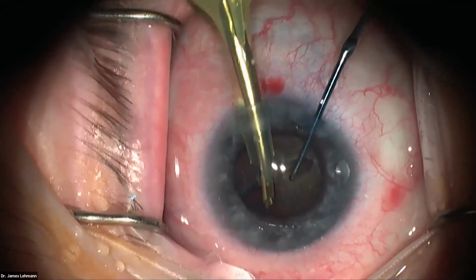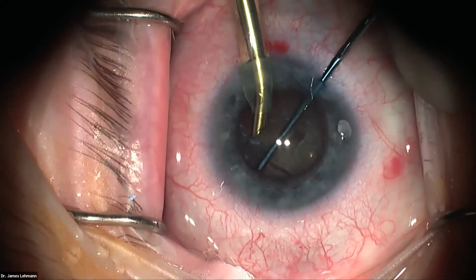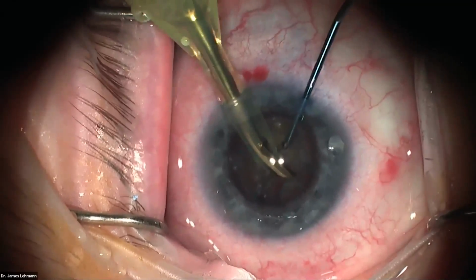Okay, so instead of going and reaching it here, I'm going to go ahead and rotate that and try another piece, since that little shelf on the anterior part is gone, so that I always have something good to grab onto.